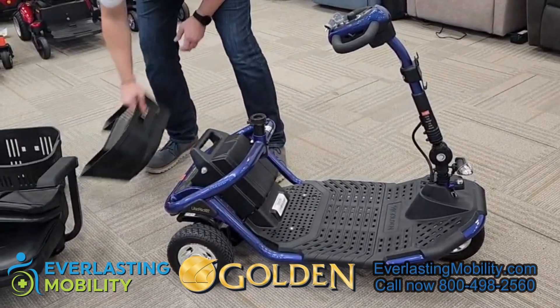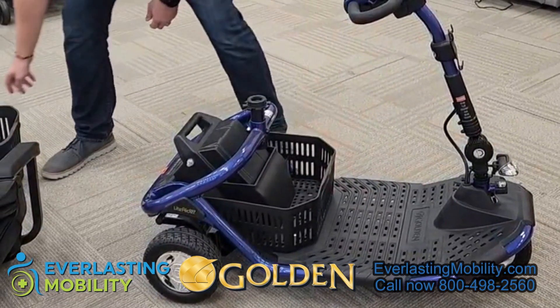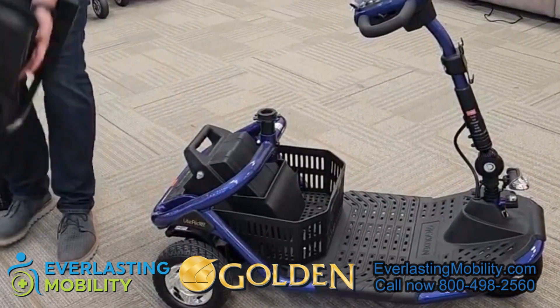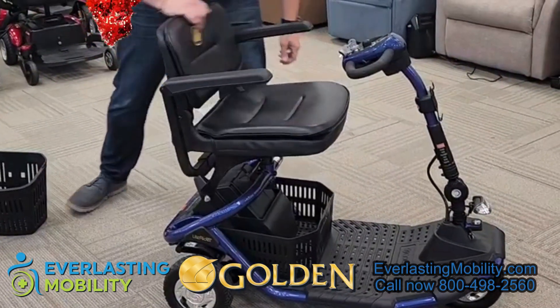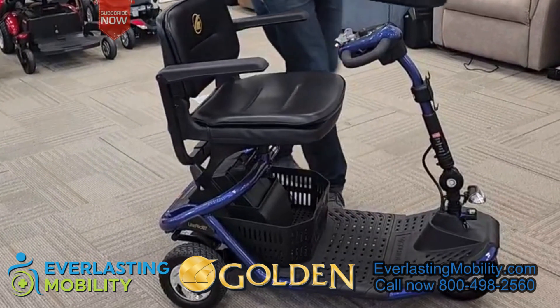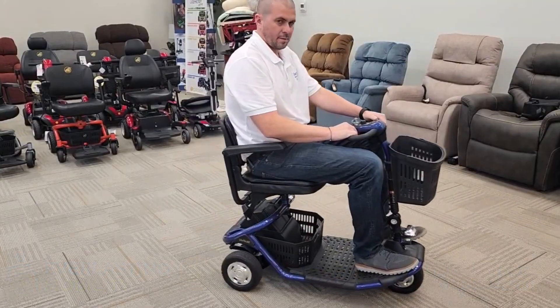Then put the bottom basket back underneath where the seat goes. Pick up the seat, make sure the prong lines up with the hole, and slide it right in — just make sure it's angled correctly. Flip the seat back up, put the front basket back on the hooks, and you're ready to go.